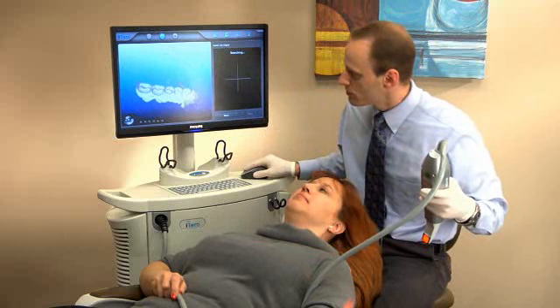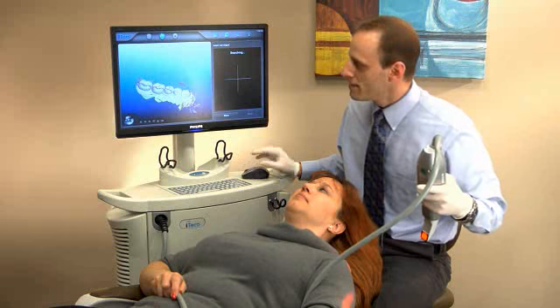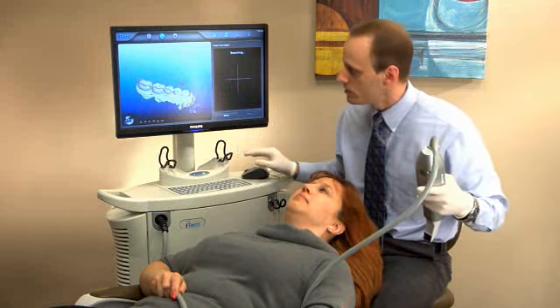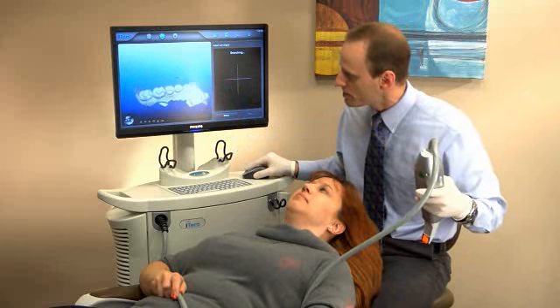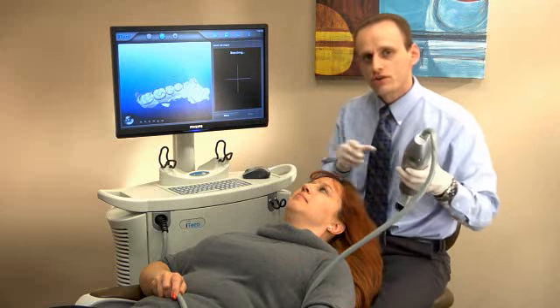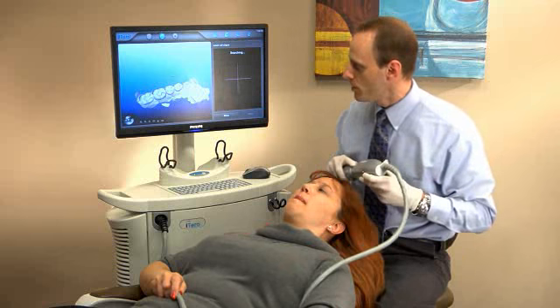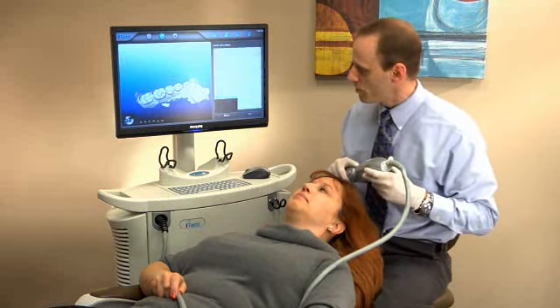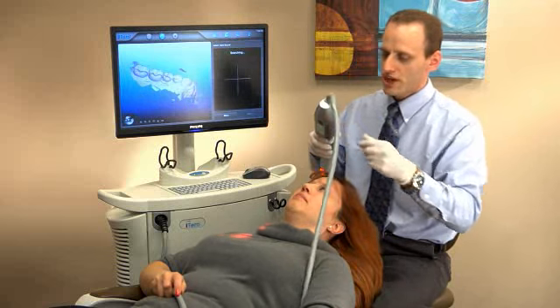Again, small little areas that are missing are okay. Anything large where I have to imagine a curve or shape, I would take an additional scan, but in this case, everything looks okay. So I'll continue by pressing the left foot pedal, choosing next from the menu by pressing the right foot pedal, and we'll scan the right side.